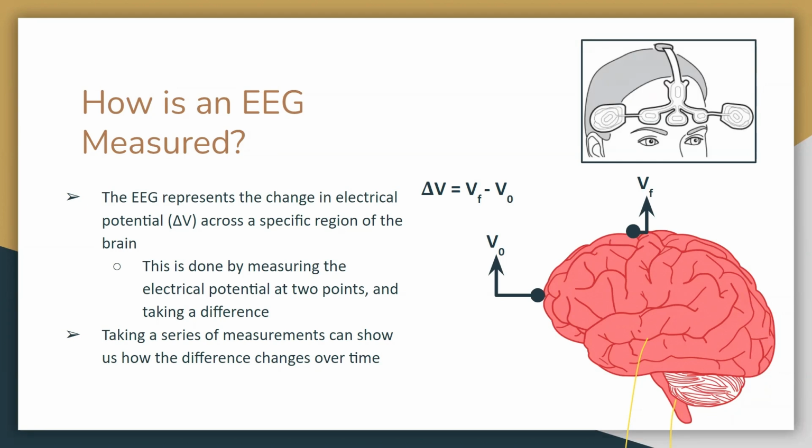I expect that it's probably more related to the electrical output. I think the machine accounts for that. When you put the pads on and it tells you high impedance, I was taught a trick by someone developing these, because we did some of the work here. When that happened, they would lift that particular electrode pad and put a little dollop of that water gel on, and then the impedance would go to normal. So there is a range within which the machine considers the signals accurate, and if it's outside that, it's going to read high impedance.